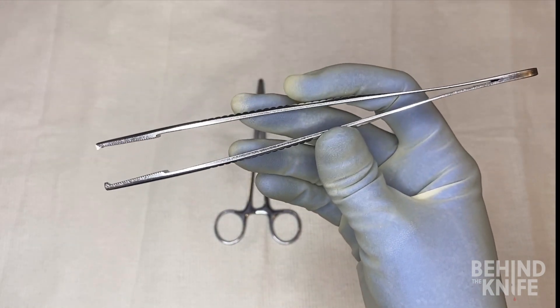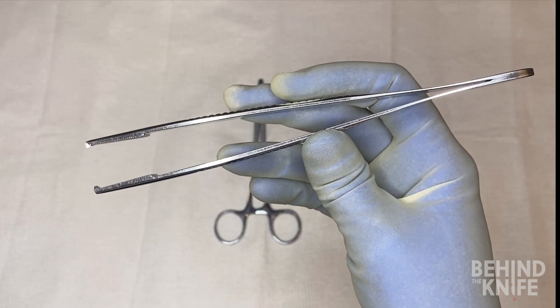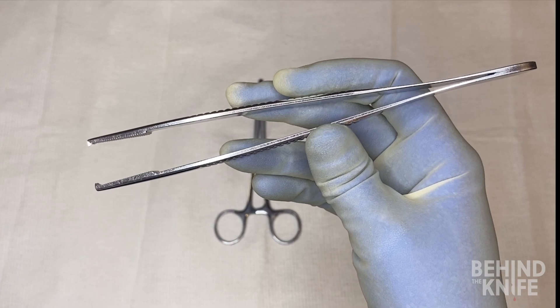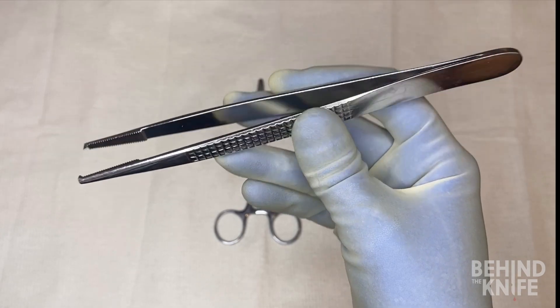Many of us will want to apply a lot of pressure when using this instrument to pick up tissue, but that generally isn't needed and may even cause your forceps tips to cross. Gentle to moderate pressure is all that's needed.